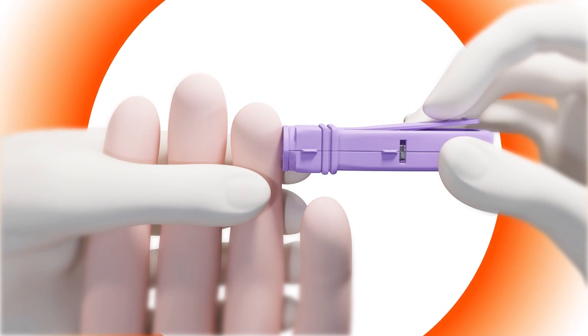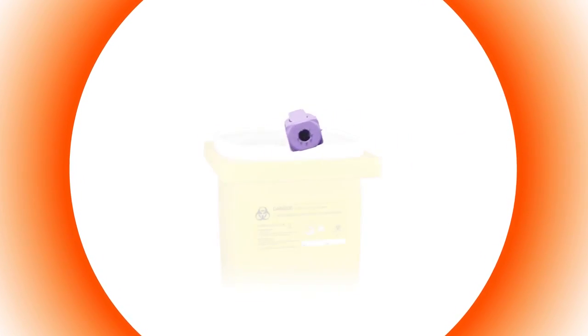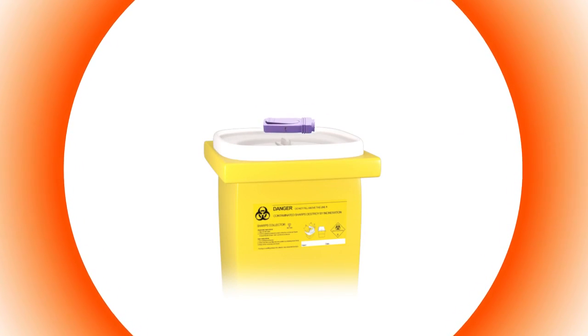The needle will puncture the skin and then automatically retract into the body of the device. After use, the UniStick 3 can be disposed of in a suitable sharps container.